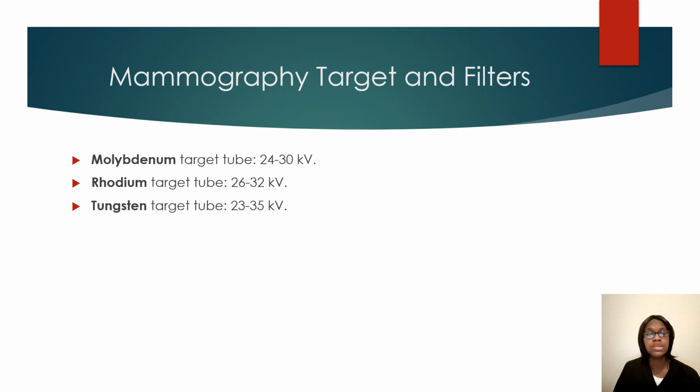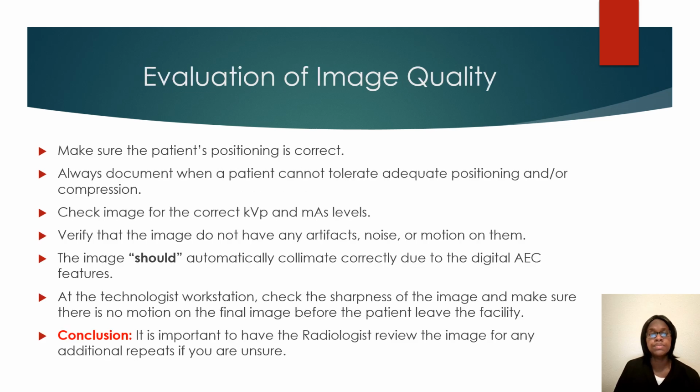Mammography target and filters. Make sure that you know all of your targets. Make sure that you know your range. This is very important. Also, whenever you are doing QC, you can see these different targets that you have to change. And whenever you're taking a mammogram image, pay attention to see what filter or target is being used.